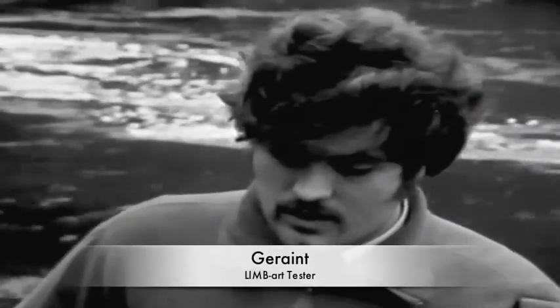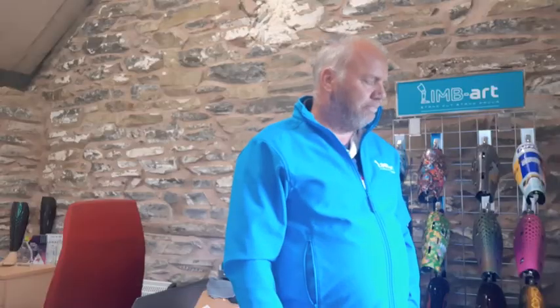We go over to Geraint, our official Limart tester, and ask him, Geraint, why do you want to do this with a leg cover? Mainly because it's a challenge. It's a personal challenge for me.